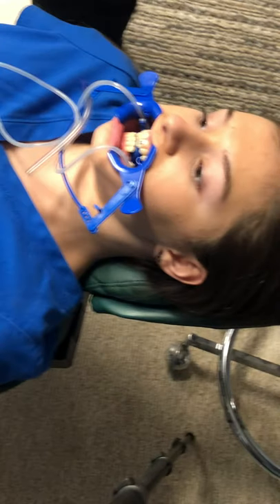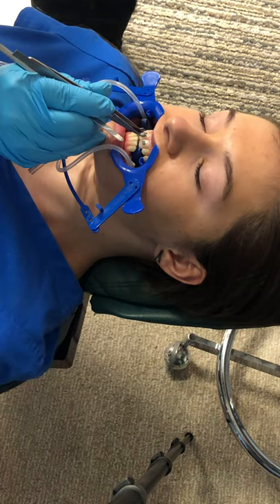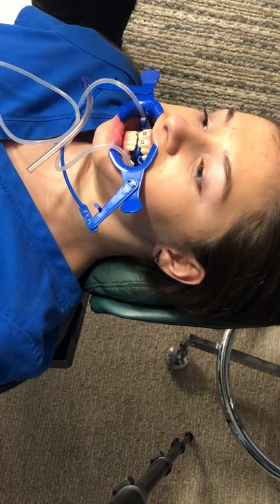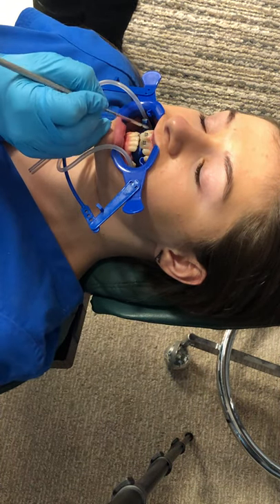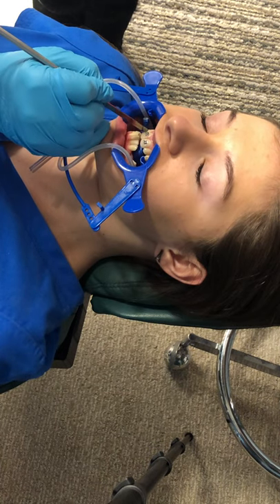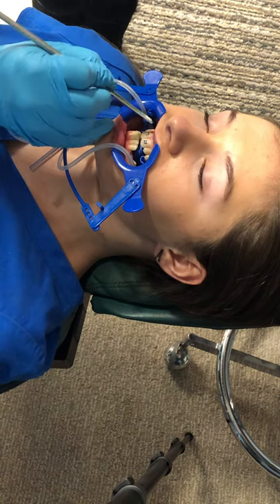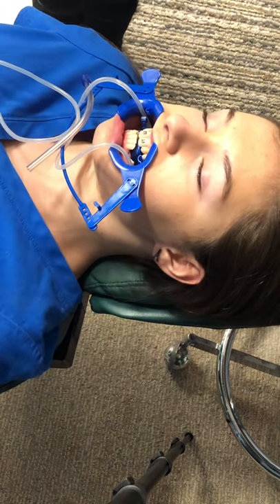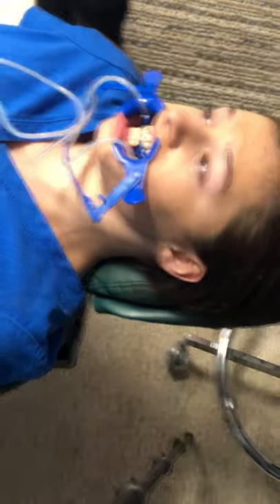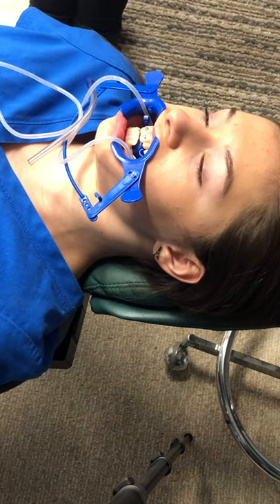Here's the upper right one, and you see there's a white dot. If this is the midline, the part of the tooth furthest from the midline is the distal. It always points distal-gingival, pointing towards the gum. Does that make sense? How many more teeth do we have to go?